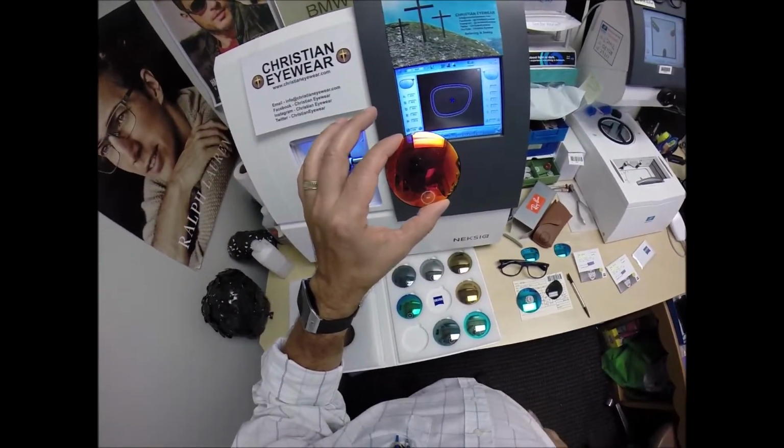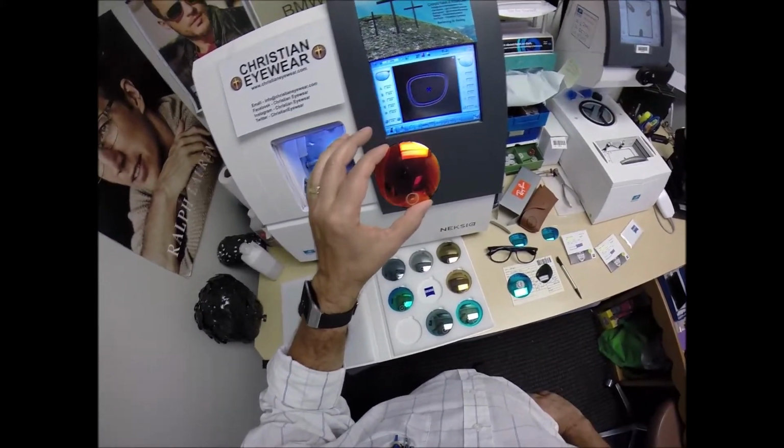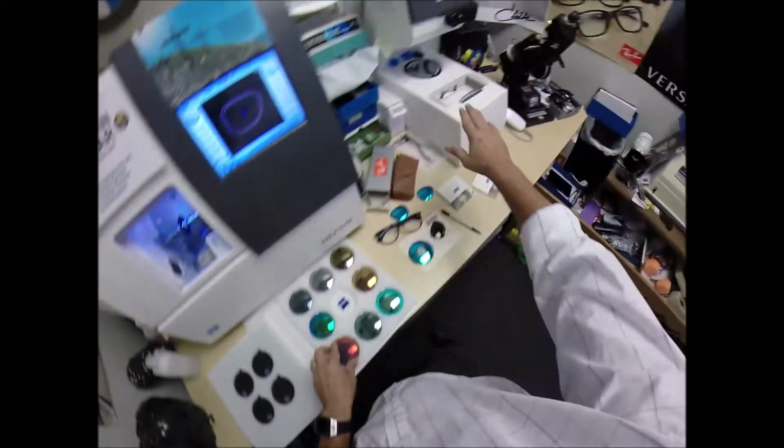So if you want red, I'll do it for you, but I'll make these for you, I should say, but I cannot cut them here. I have to send them off to Zeiss. Zeiss will cut them. They have a different blocker.